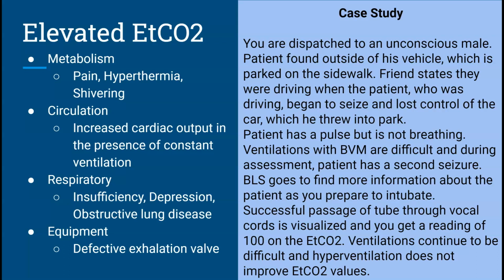Successful passage of the tube is visualized through the vocal cords. You get a reading of 100 on the end tidal. Ventilations continue to be difficult, and hyperventilation does not improve end tidal. What are your thoughts about this patient?